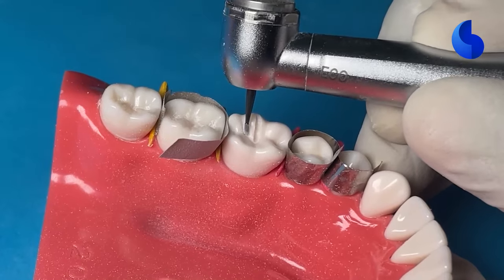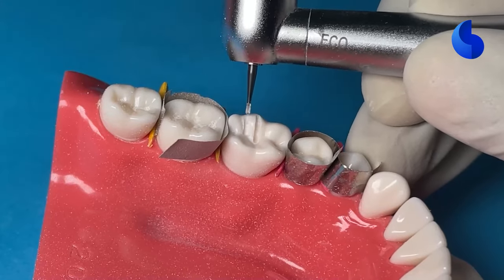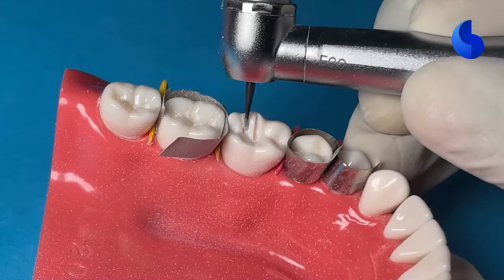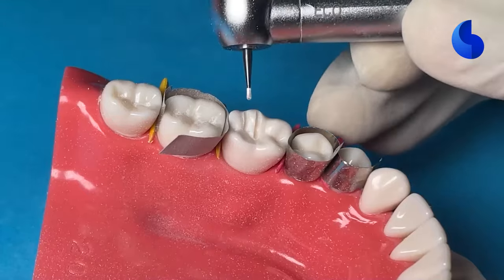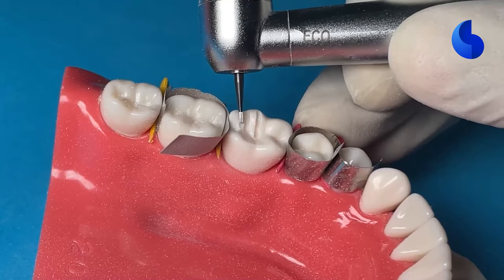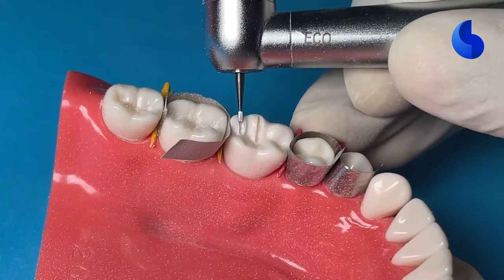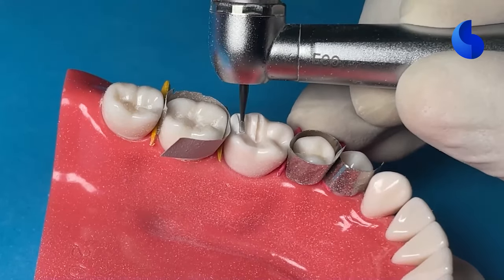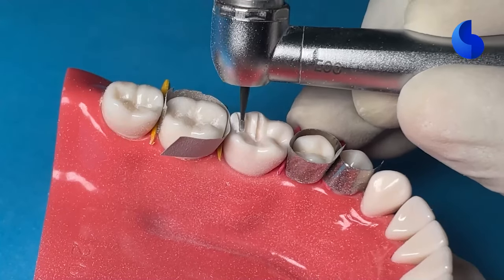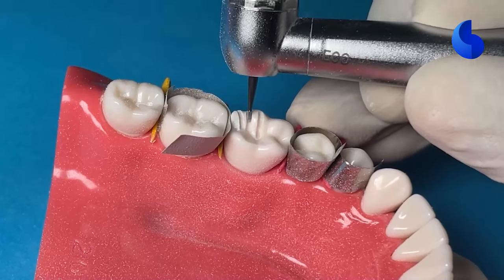occlusal surface, especially when you're not using putty indices. A putty index I would highly recommend because that gives you an idea of how much you've reduced so that you're not under reduced, which becomes a critical error. However, if you're not able to make a putty index, then these depth orientation grooves will really help you stay aligned and gives you an idea of how much you're reducing.